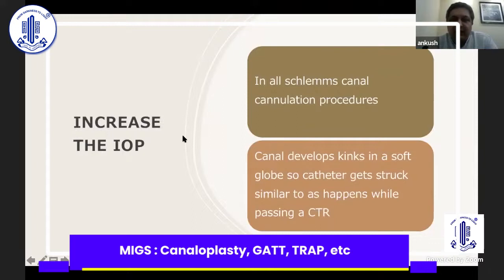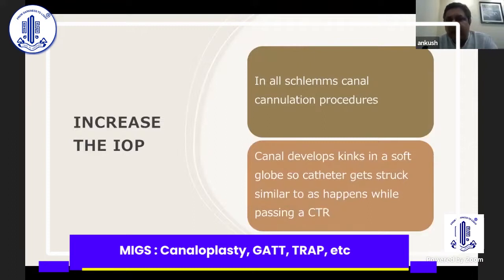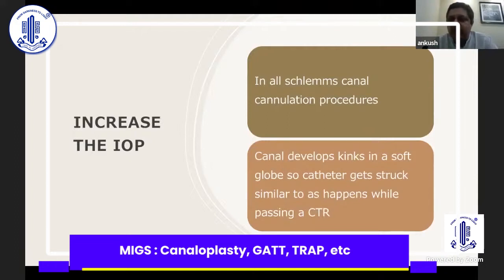If you are doing it under low IOP, it will be difficult to cannulate the canal, whether using a catheter or a suture. The canal will develop kinks in the soft globe and the catheter will get stuck — which is similar to what you see when you are putting a CTR in a floppy bag. If the bag is floppy, the CTR will not pass through.